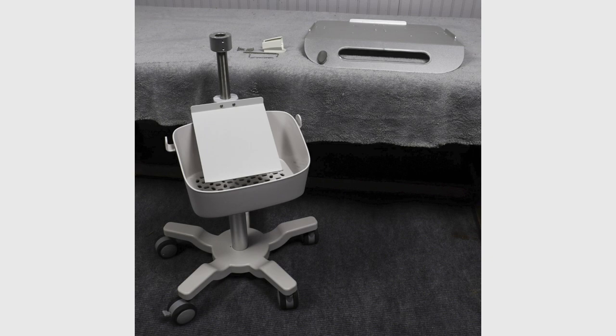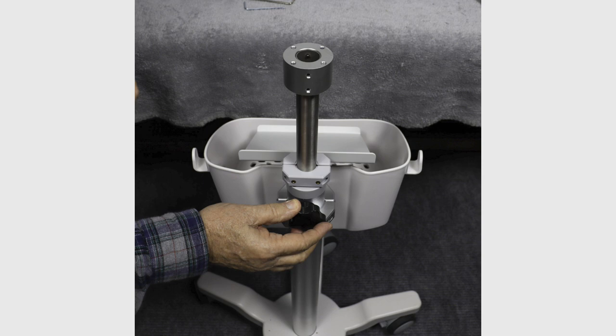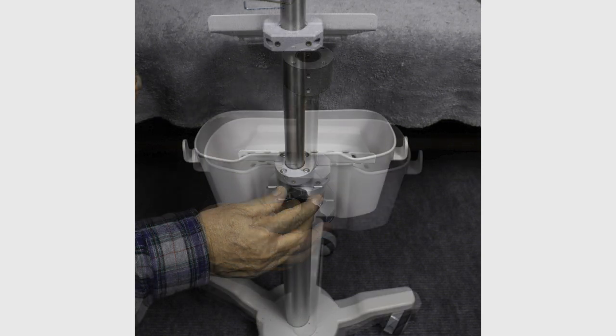Unbox the ABI stand components and lay out in an orderly fashion. Turn the black plastic knob one half turn counterclockwise and fully extend the shaft.